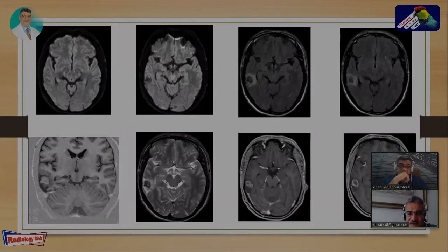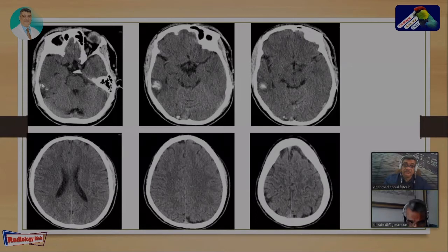And these are the other pictures. We say that this is a hyperdense lesion, and the surrounding area on the CT scan can be due to focal atrophy, for example, and the density is very hyperdense, can be like bleeding.